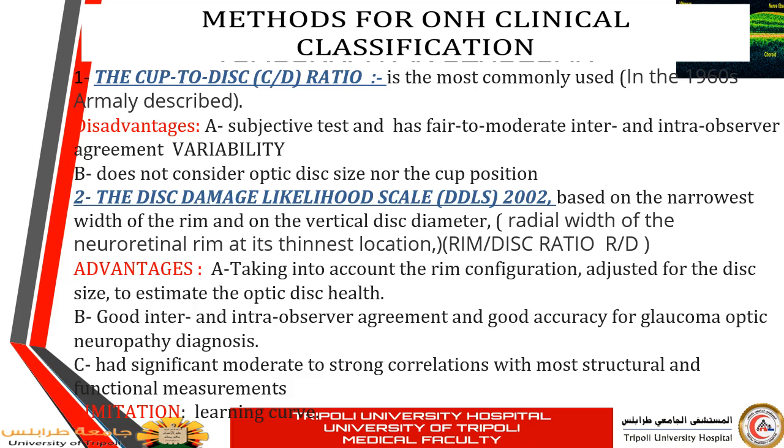Although imaging of the optic nerve has advanced, and many machines like the OCT and the GDx have been developed, along with functional machines like perimetry, examination of the optic nerve remains the gold standard for any assessment, diagnosis, or follow-up of a case of glaucoma. And that's for many reasons.